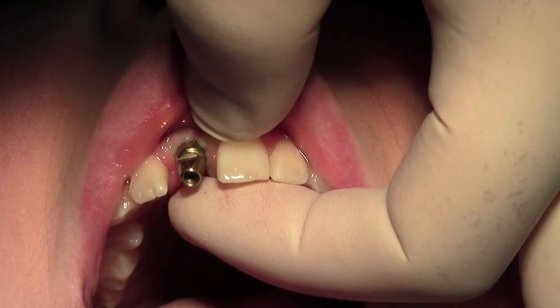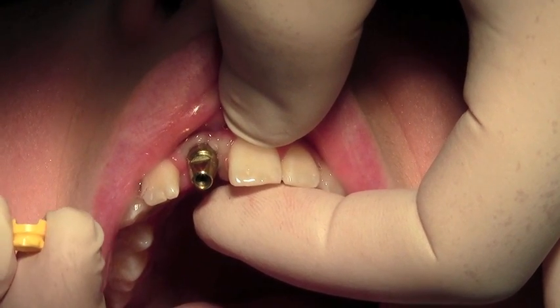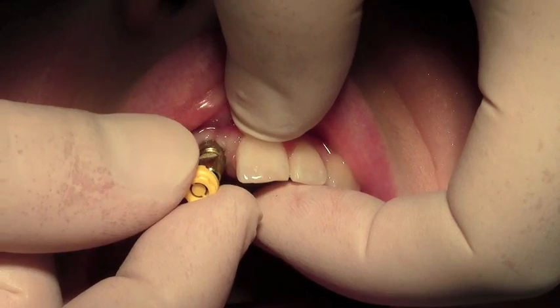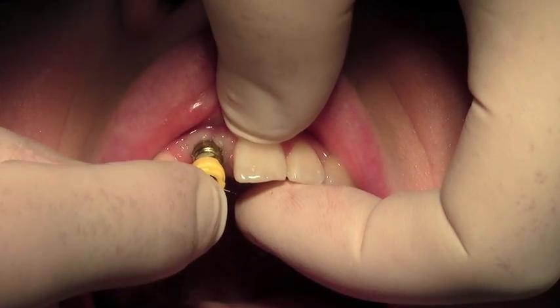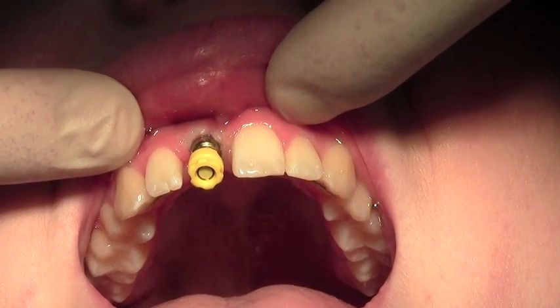We take the driver out and next I'm being passed the transfer cap. This is the colour matched yellow transfer cap that sits on the impression post — and there we are, ready for the impression.